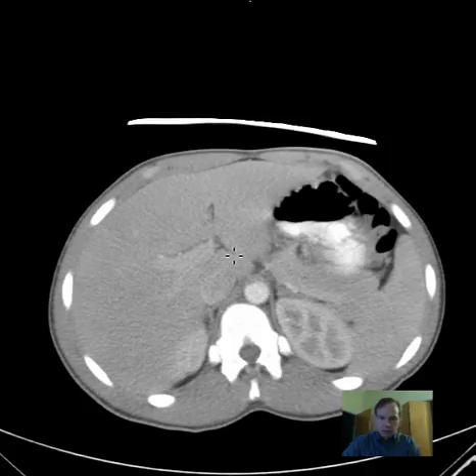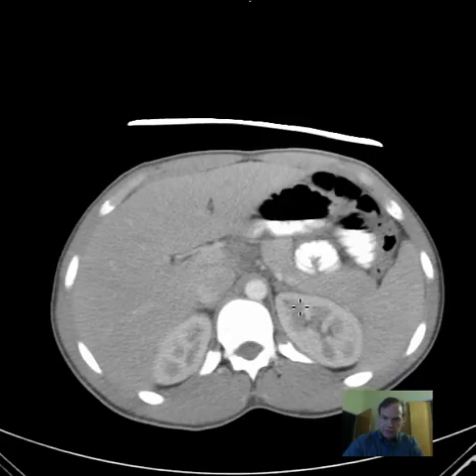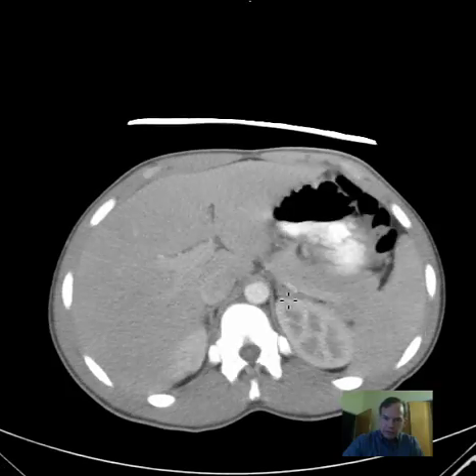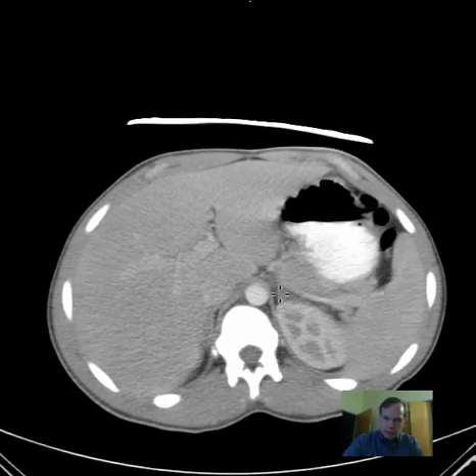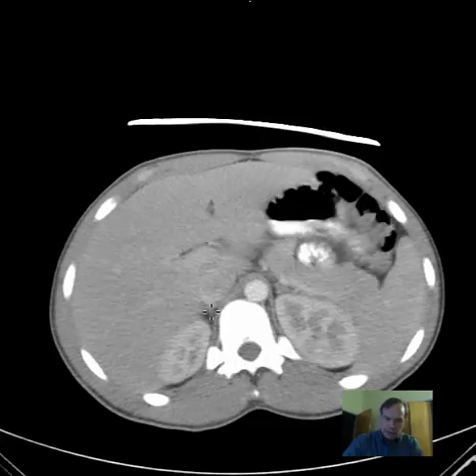The adrenal glands are difficult to visualize, but here's one on the right, very thin, and here's part of the adrenal gland on the left. You can see it's anteromedial and superior to the upper pole of both the right and left kidney. This being the left adrenal gland and the right adrenal gland being here.